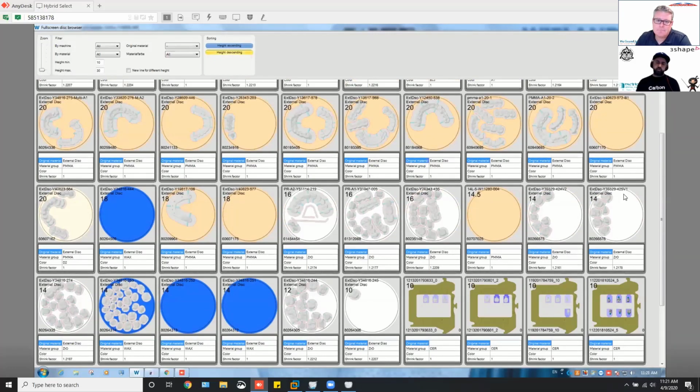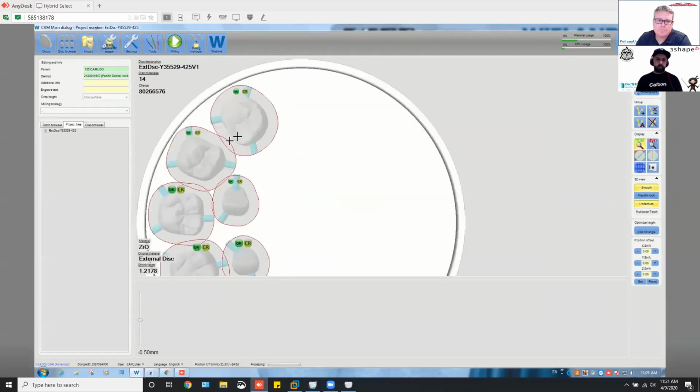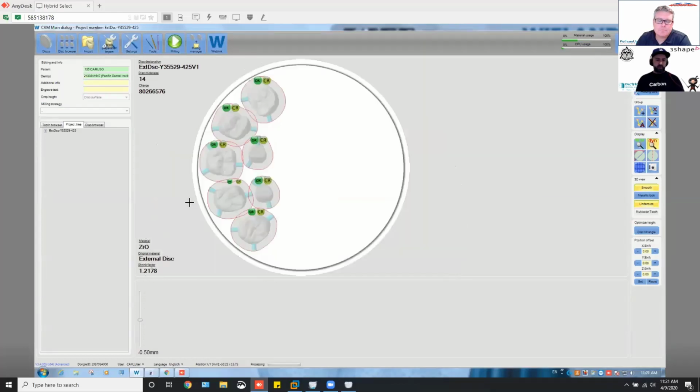If I just want to get the case started, I think the first couple of runs it's throw and go. So like you can see here, I've started here, maybe in the center, and I go 1, 2, 3, and I'll get these going, and then I'll come in here, I'll place 1, 2, 3 right here, or 4, and maybe I'll come in here and cut this out before the disc. But sometimes I switch it up. You can see I got the 2 prong going on here. On these molars, I've done 3.